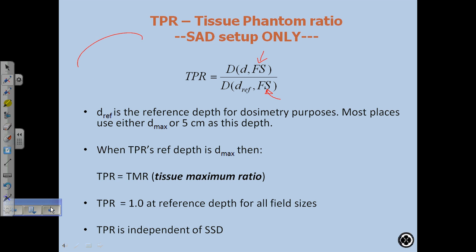And usually, if this is the patient and we're treating with a beam, we're calculating to the center of the patient. And so this depth is rarely 30 centimeters if we're doing a calc, because then that would mean the patient's 60 centimeters. That's a pretty big patient. So these depths are usually up to 20 cm for a new calc, for a new dose. Now, you may want to calculate the dose to a point down here, just to know what it is. Then that's where the 30 depth, or the deeper depths, would come in.